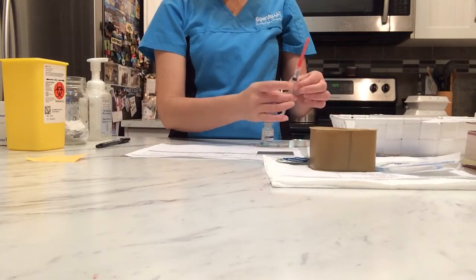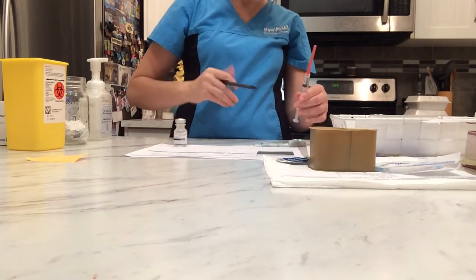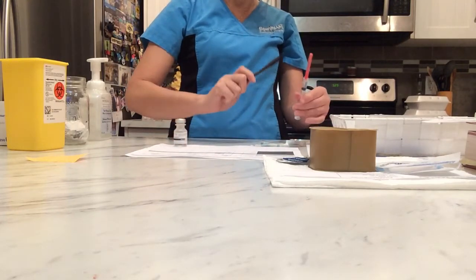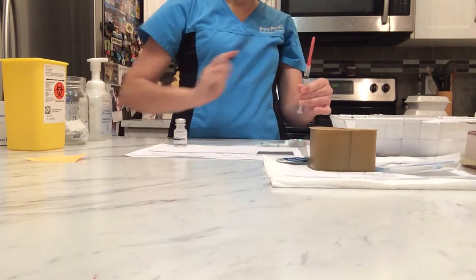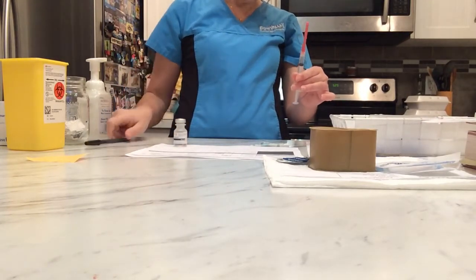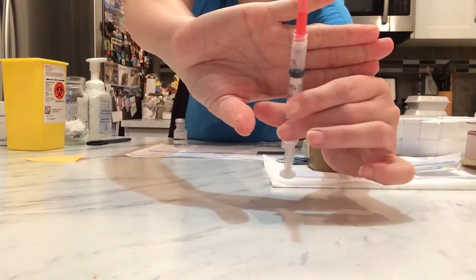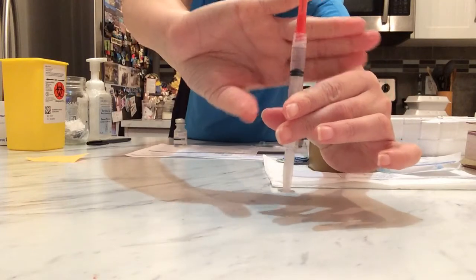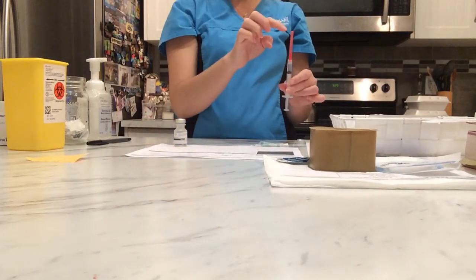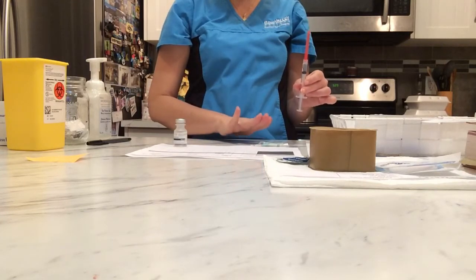Okay, I'll double check for bubbles, and I think I have a little one here, so I'm gonna use my pen. Okay, one more time, no bubbles. And I'm gonna use the medication that I have in my needle to prime my next needle.